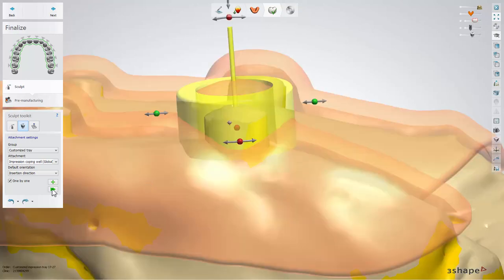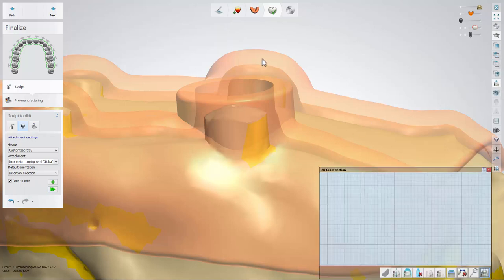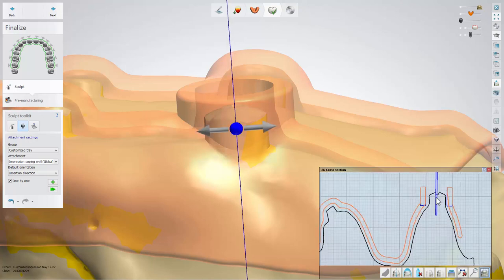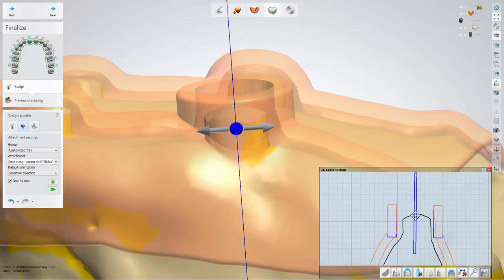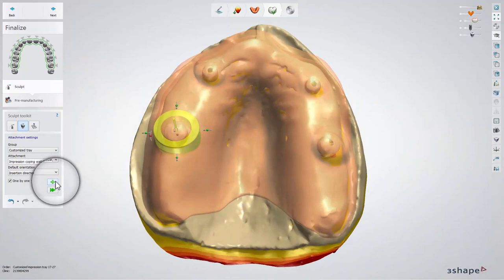We also advise choosing the 2D cross section and checking, after placing an attachment, if the impression coping well is placed in the right position. Continue placing coping well for each implant.